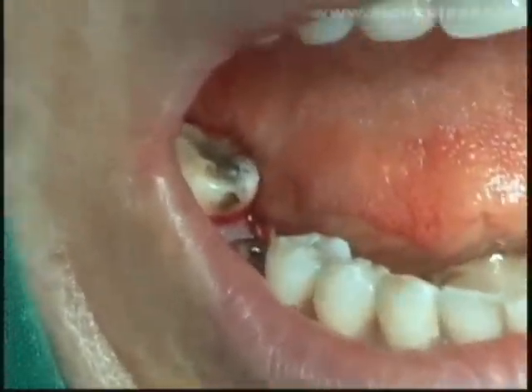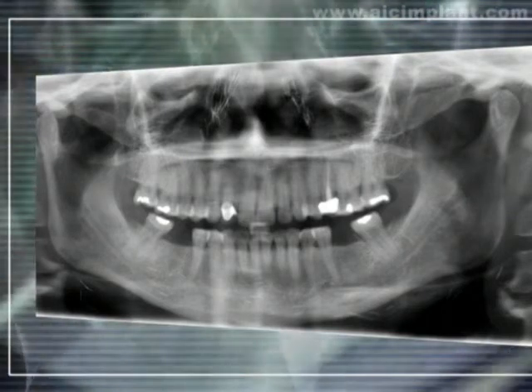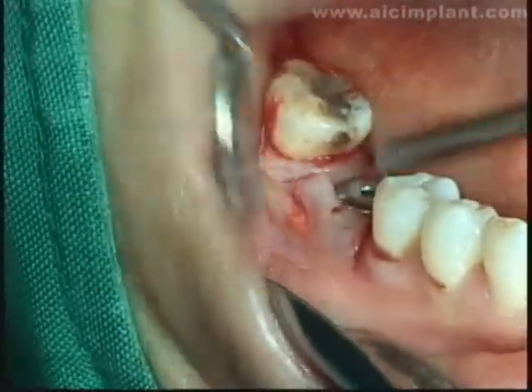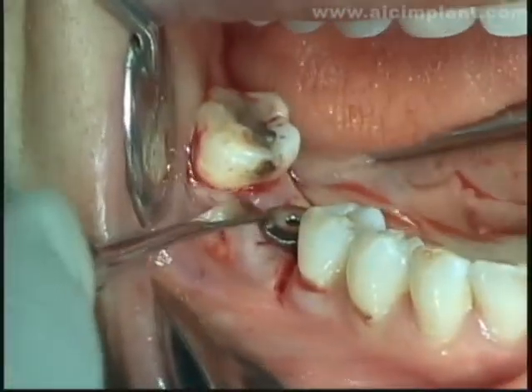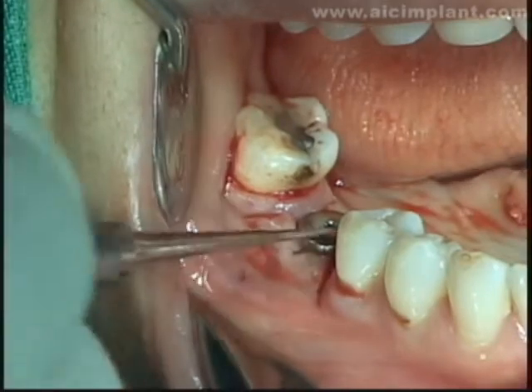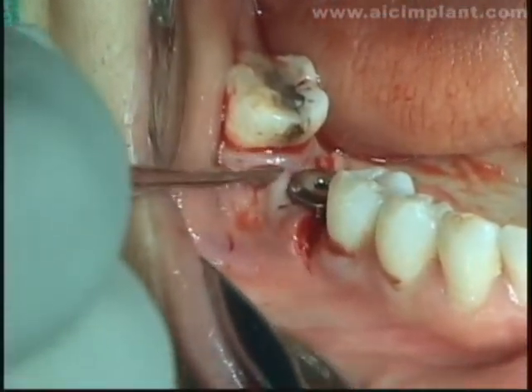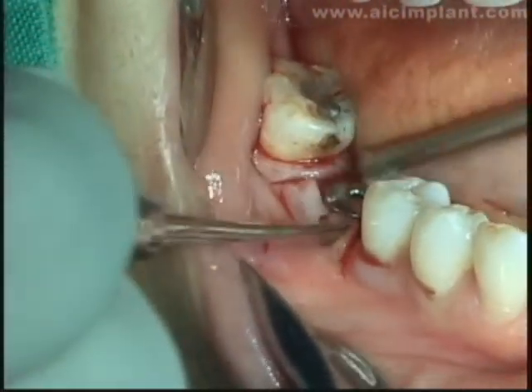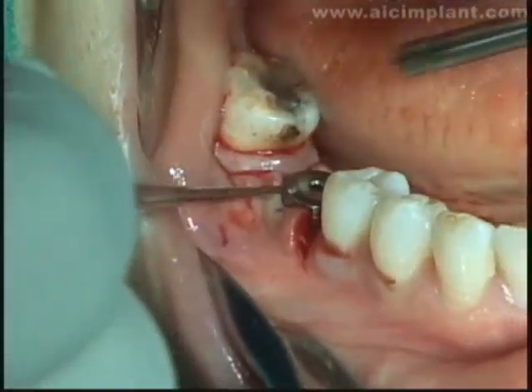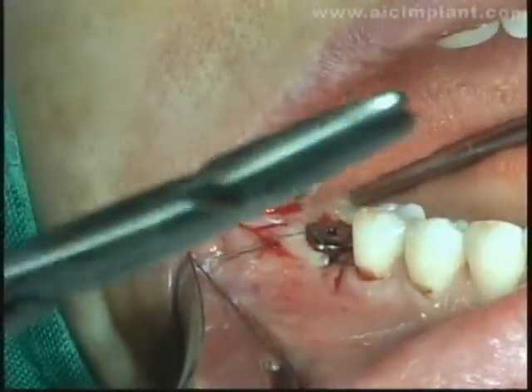As I mentioned earlier, you can easily see that an incision of this design may pose difficulties during suturing. The circular incision needs only about 2 interrupted sutures, whereas an incision line left around the healing abutment may be a disadvantage. Ideally, the healing process and pain relief should gain primary closure around the healing abutment if possible.